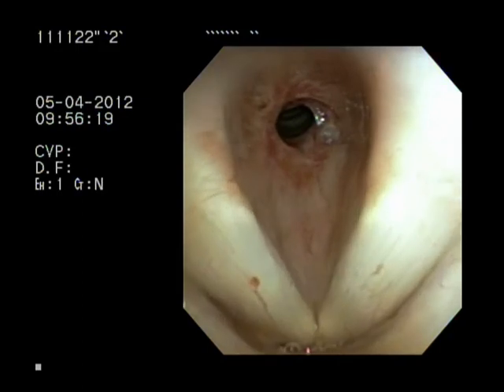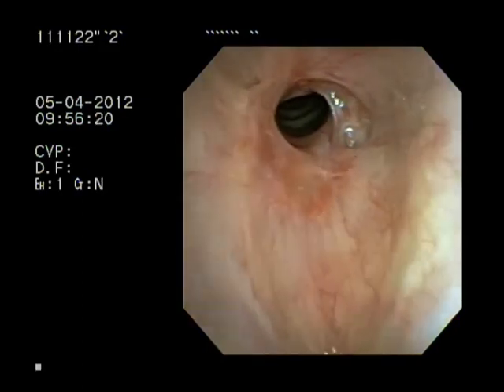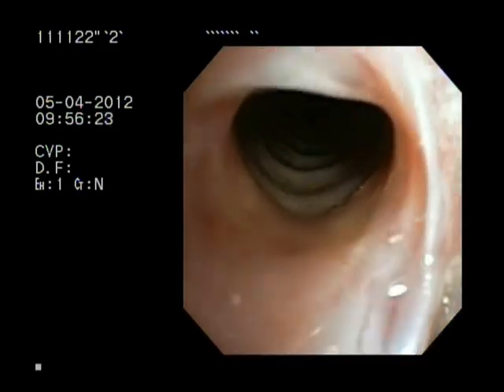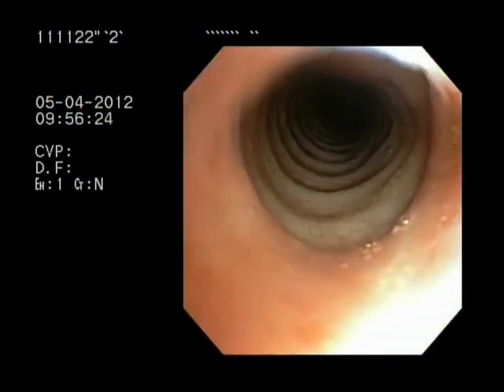This next stricture is a Meyer Cotton 3, McEffrey 3, Lano 2.